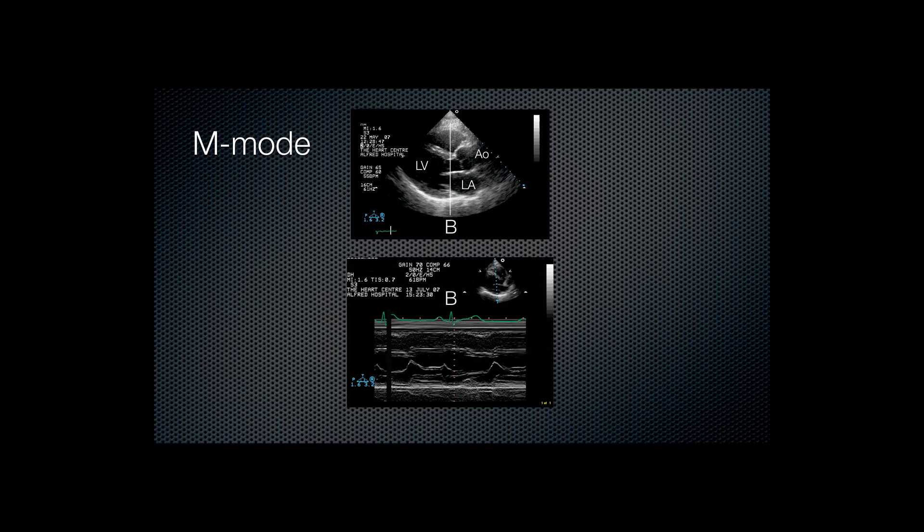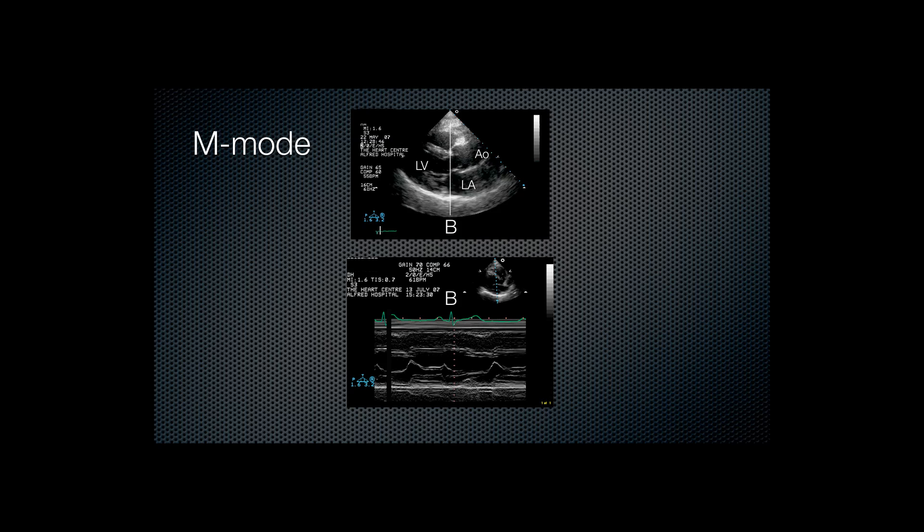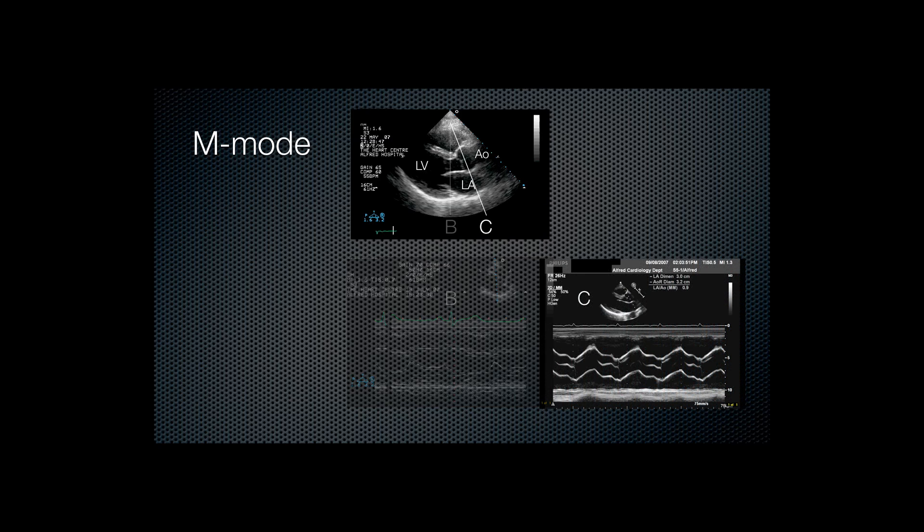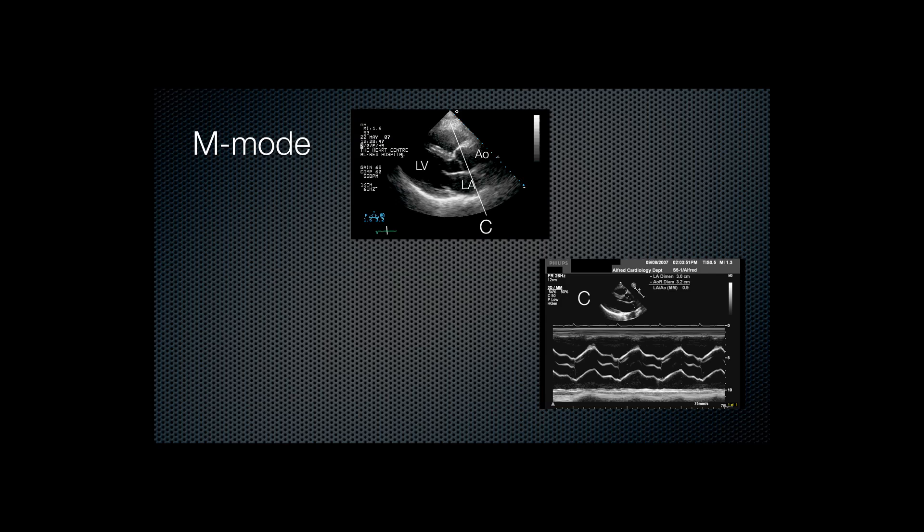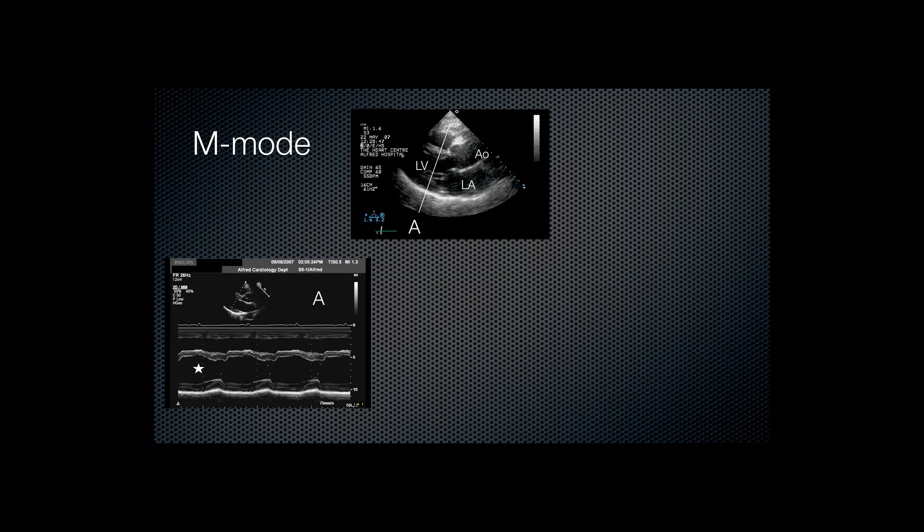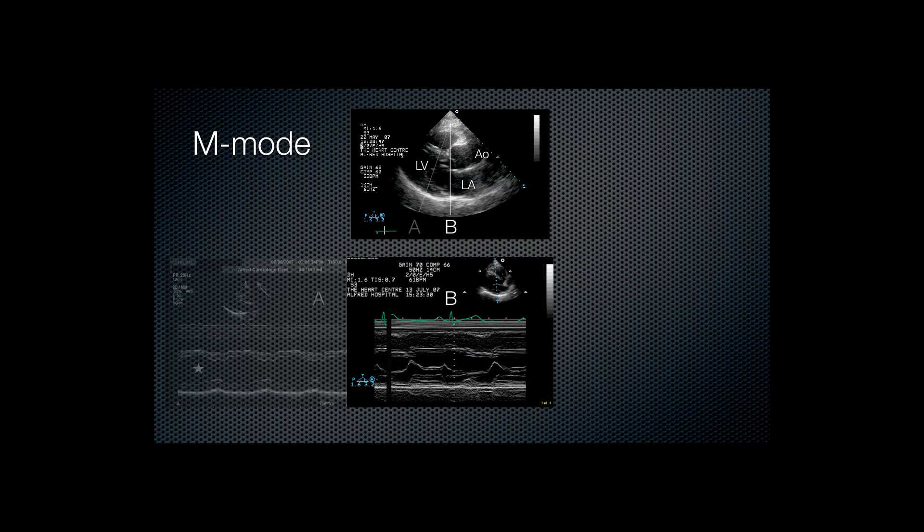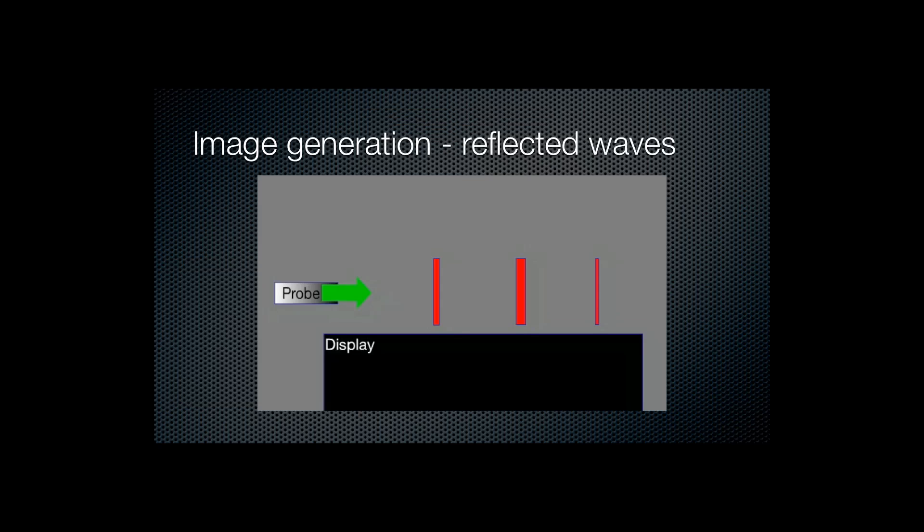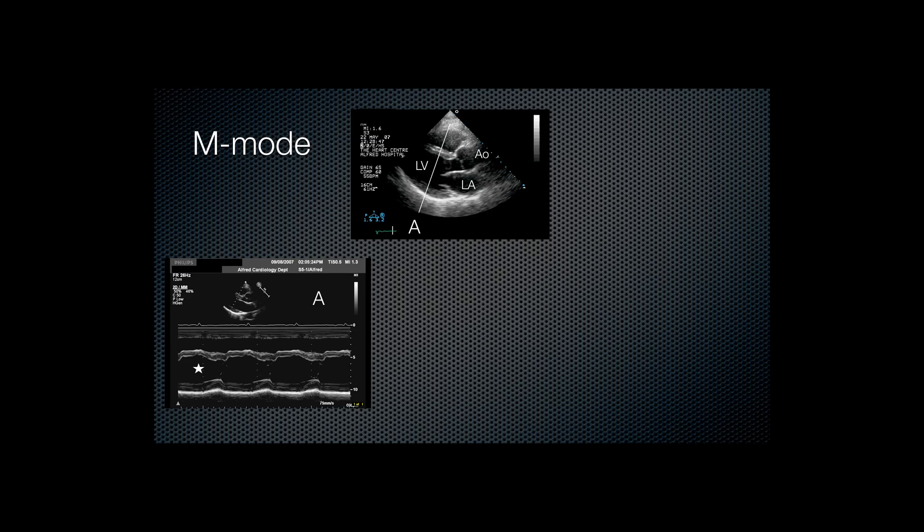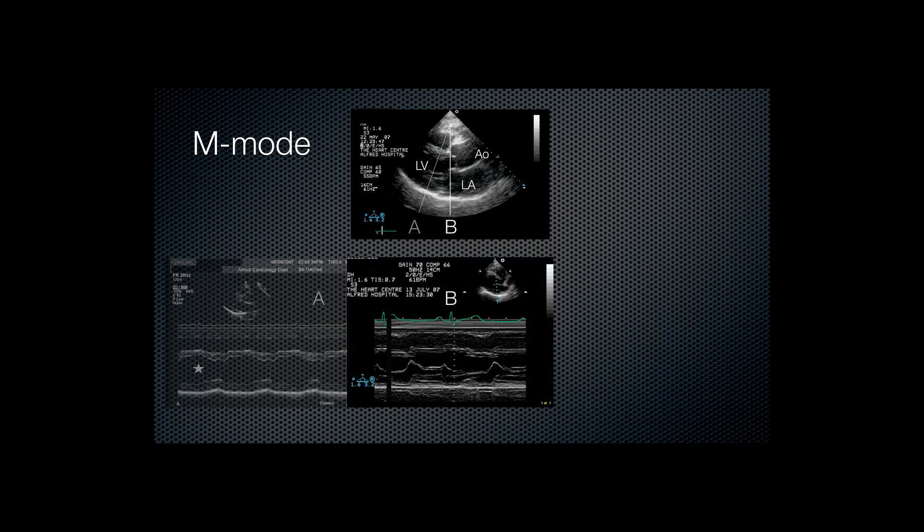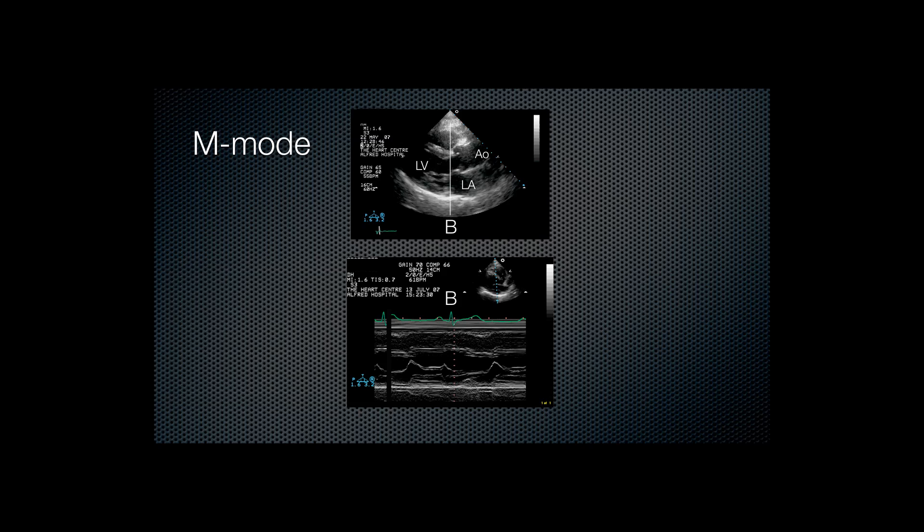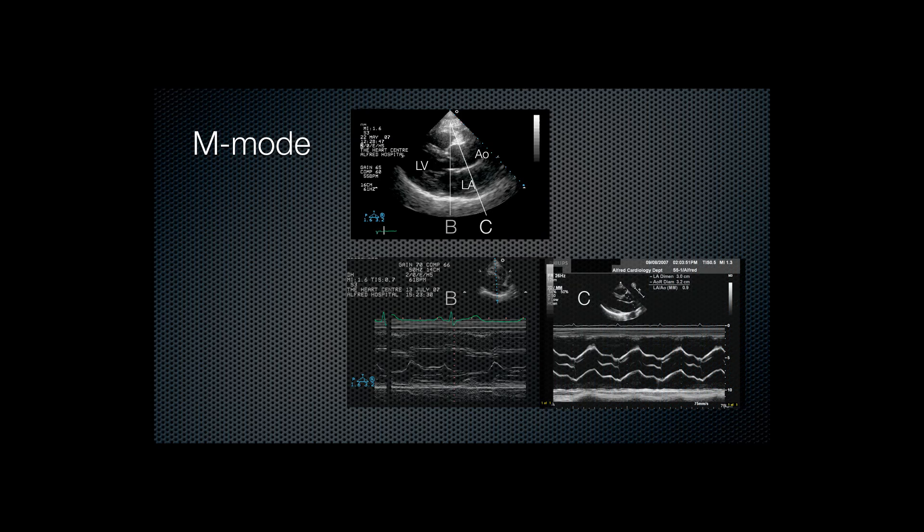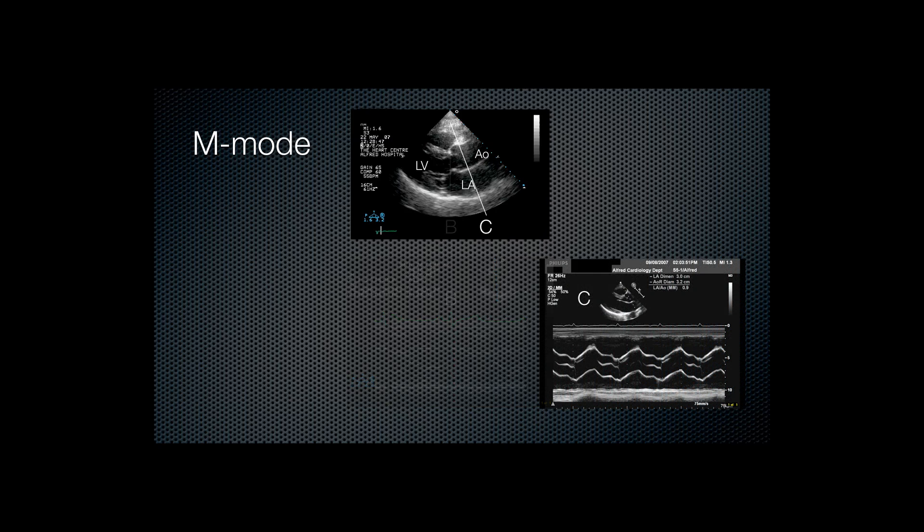So as labeled, left ventricle on the left, left atrium as a deep structure, aortic root heading off towards the right of screen. Line A represents a single line of sight passing through the ventricle, and the image generated shows the left ventricular cavity.